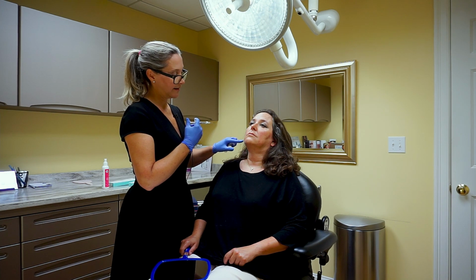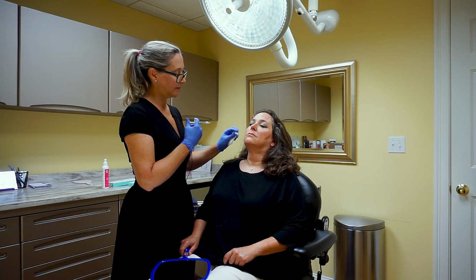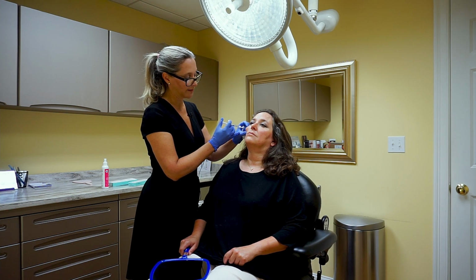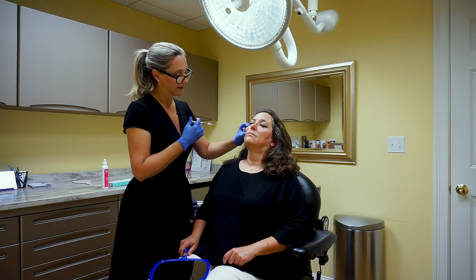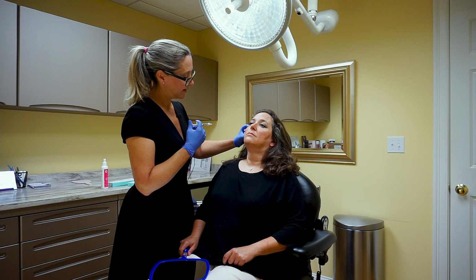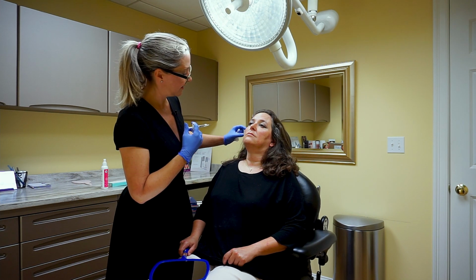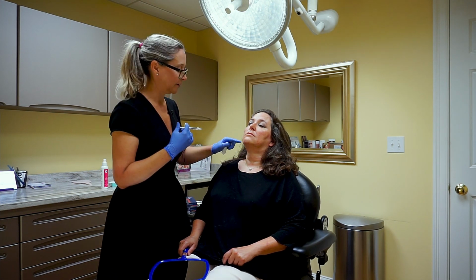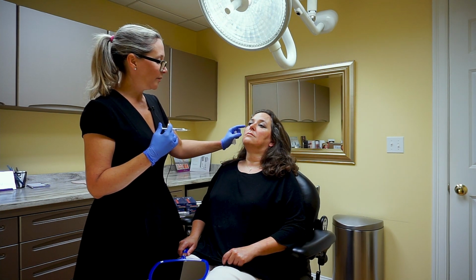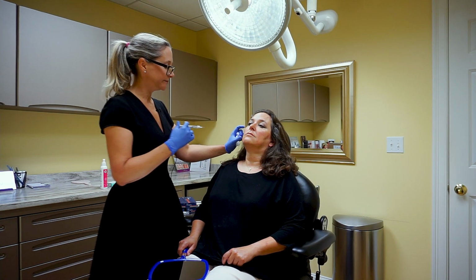And you can see that even if you're looking down here, the part of her jowl won't drop down because we've gotten the cheek elevated a little bit. I can see a correction here, and you're starting to see that I'm creating more of a high cheekbone.